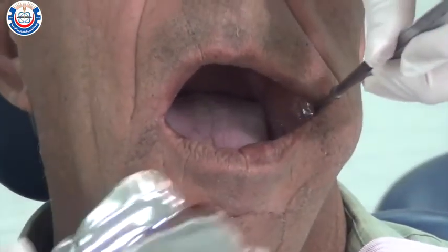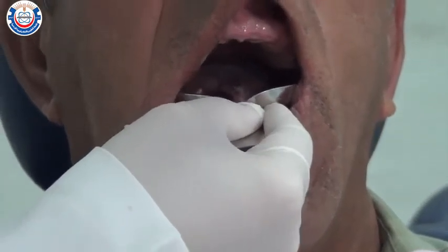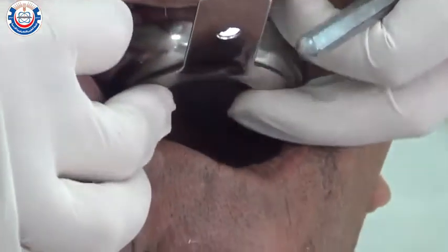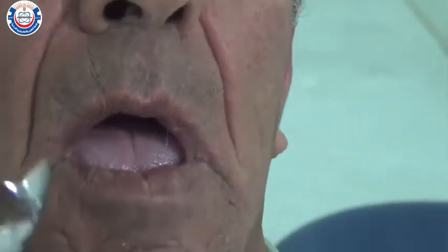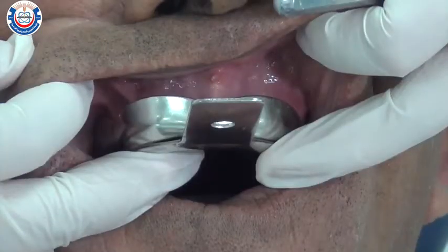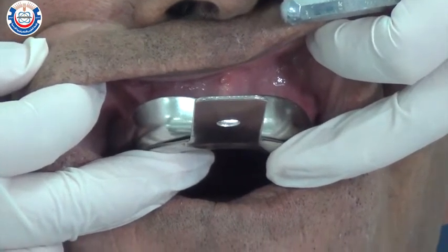To select the appropriate upper tray, stand behind the patient. With one hand, retract the cheek using the mirror, and with the other, retract the cheek using the tray. Rotate the tray into place and position the distal end as posteriorly as possible, distal to the maxillary tuberosities. Rotate the tray anteriorly until it's seated over the anterior area of the ridge. There should be about 6 mm space between the residual ridge and the tray, and the tray should cover the whole edentulous area. Note the difference when a smaller tray is used — the area is not covered properly and the tray is short from the depth of the sulcus. So when in doubt, always select a larger tray.